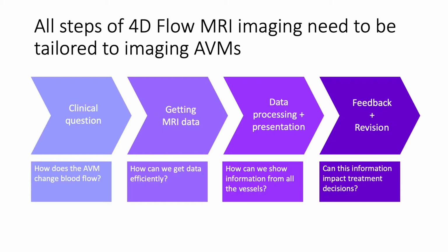And then finally, we get feedback from clinical collaborators, and we try to revise this whole process so that we can really see whether this information can impact the treatment decisions that physicians and patients are making.